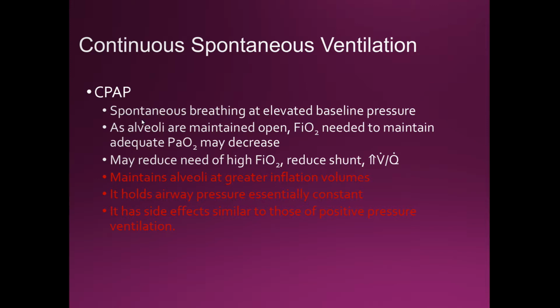All right, so for CPAP, CPAP is spontaneous. Alveoli are maintained open, and so you have better gas exchange. FiO2 needed to maintain adequate PaO2 may decrease. So for CPAP, you're going to have only one pressure, and that's going to depend what it is. It might be just +5, right? So you have +5 going into the airways. You're going to have +5 remaining in your lungs when you're done exhaling.